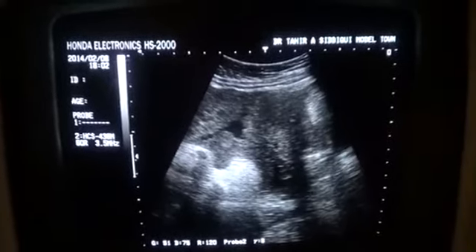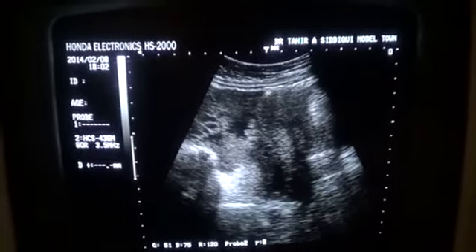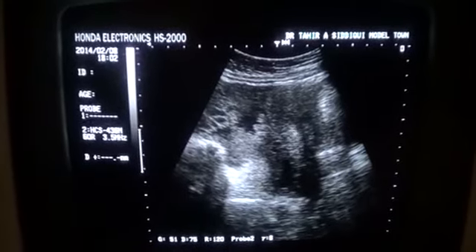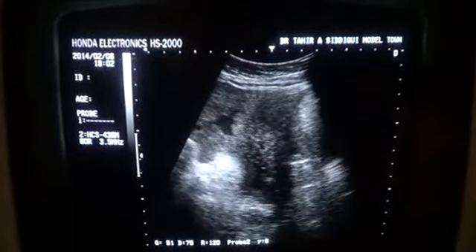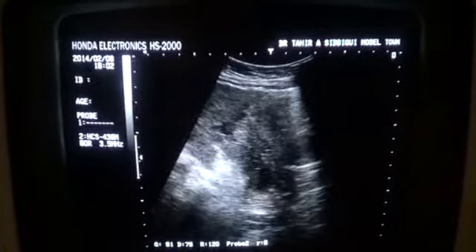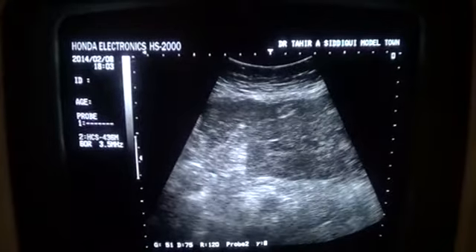This is the uterus, where now you can see the posterior wall of the uterus as well. This is the cervix, the anterior lip, the posterior lip of the cervix. Under the given situation, only this much view of the uterus can be gained by 3.5 MHz probe, transabdominal approach. This is our case of the day. Thank you very much.